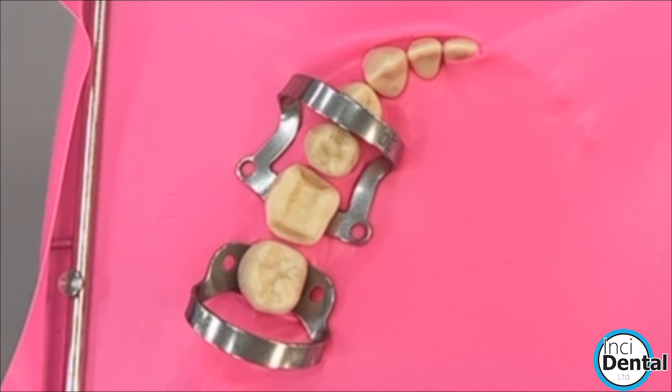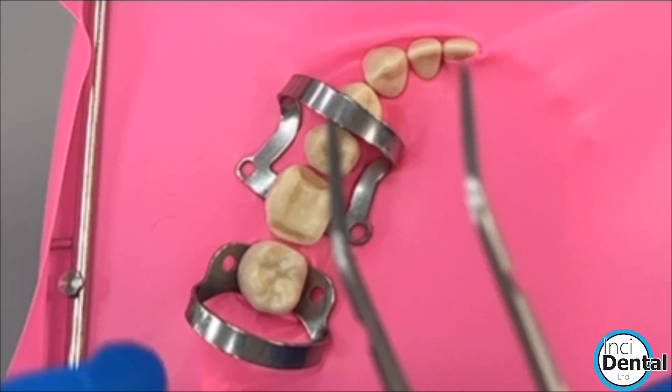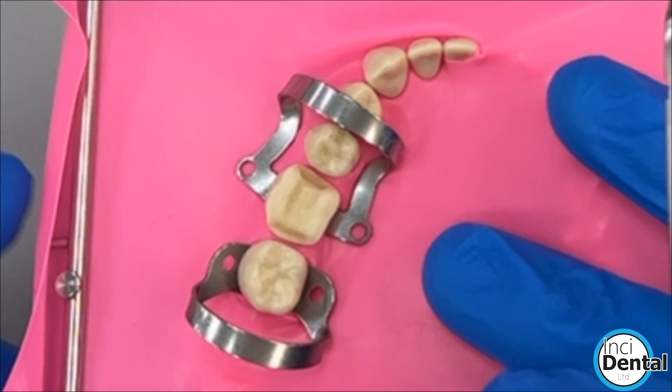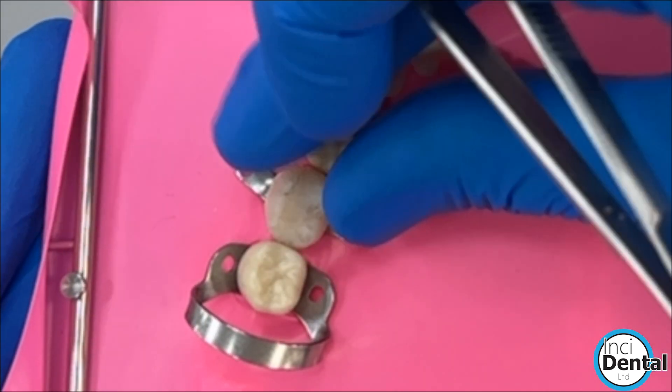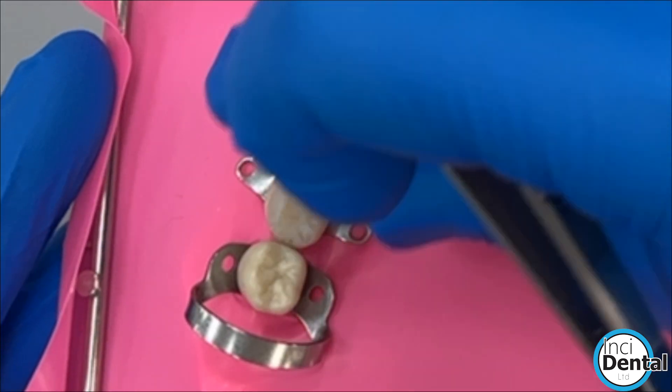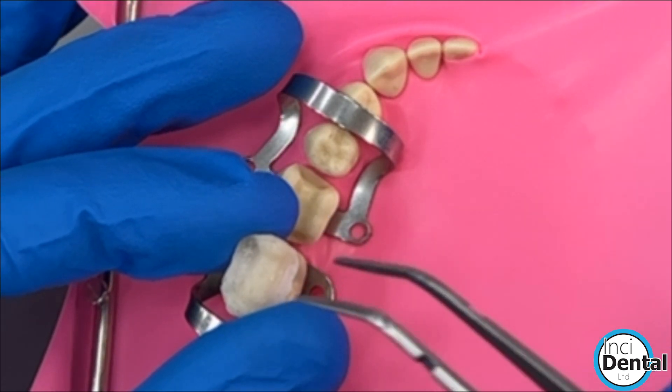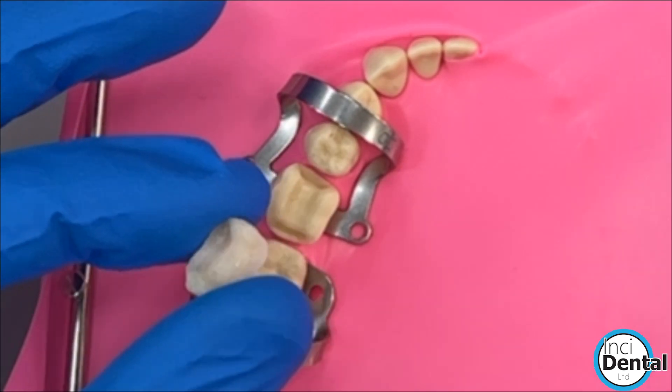Once I've got to this position, my order for cementation is: I will clean off any excess temporary cement, try in the restoration to make sure it fits, and then take it away to do the silane procedure and put the bond on.